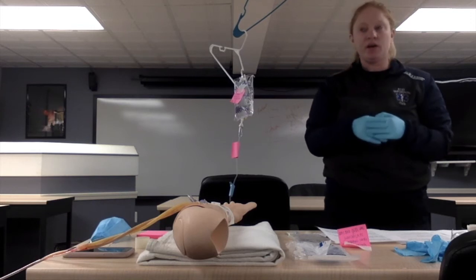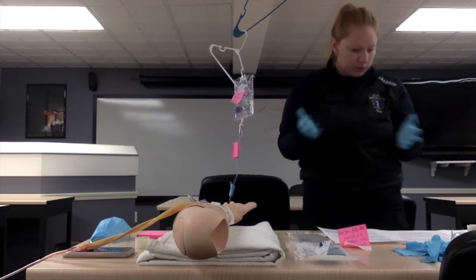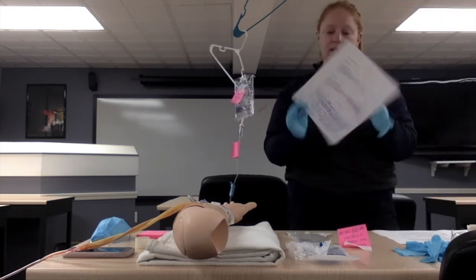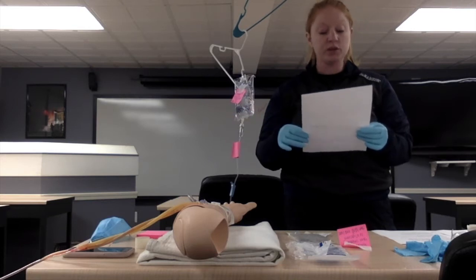Give a gram of Ancef, which is in a 50 ml bag. We're going to give that over 30 minutes, so we'll go through those steps. So again, we have our provider orders right here. So we're confirming that it's 50 mLs of Ancef, which is the 1 gram over 30 minutes every 8 hours.